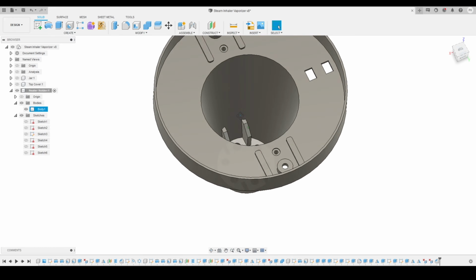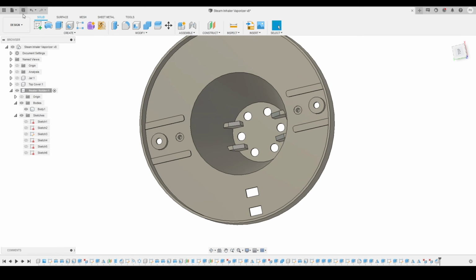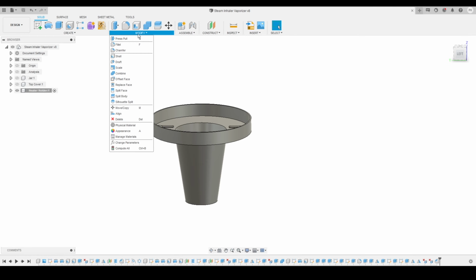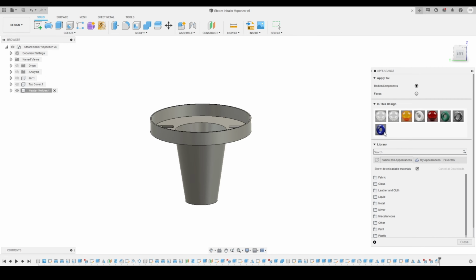So here you can see this is the shape we got after applying the chamfer. This is just to separate the blades so that they will not be able to touch each other, otherwise an explosion will happen because of high voltage or electricity. So here you can see we had just finished this shape of this heater holder. So we'll go to the appearance tab, and we are going to apply some appearance on this particular component.